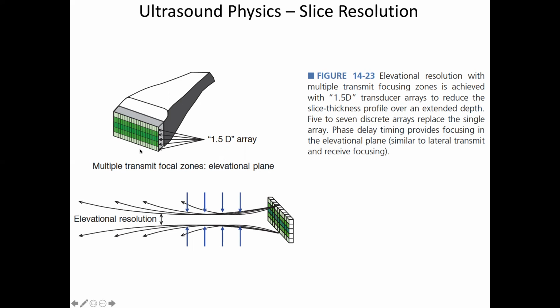Nowadays, with the miniaturization of electronics, it's not a big deal to make these things. Obviously, there's some dead space in the ability of your transducer to pick up all of the energy coming back to hit it, because if they're truly independent, there's got to be some space between them, right? And so that efficiency, I don't know what that is actually, but it's probably pretty high. It's probably like 90%, 95%.